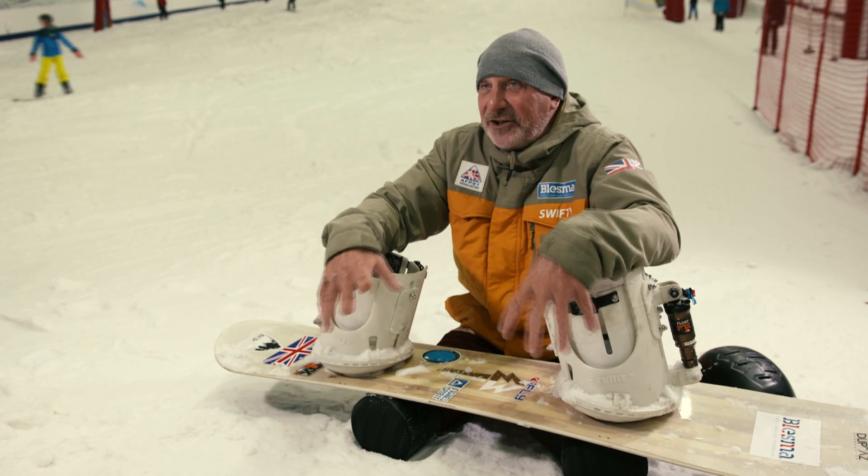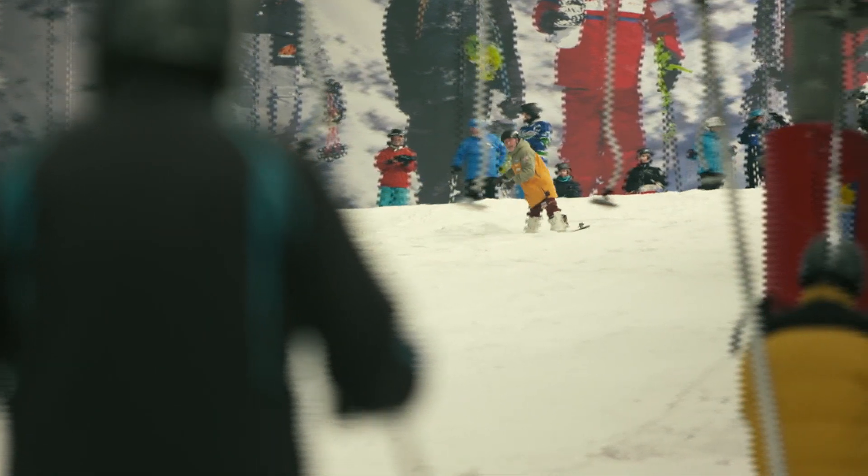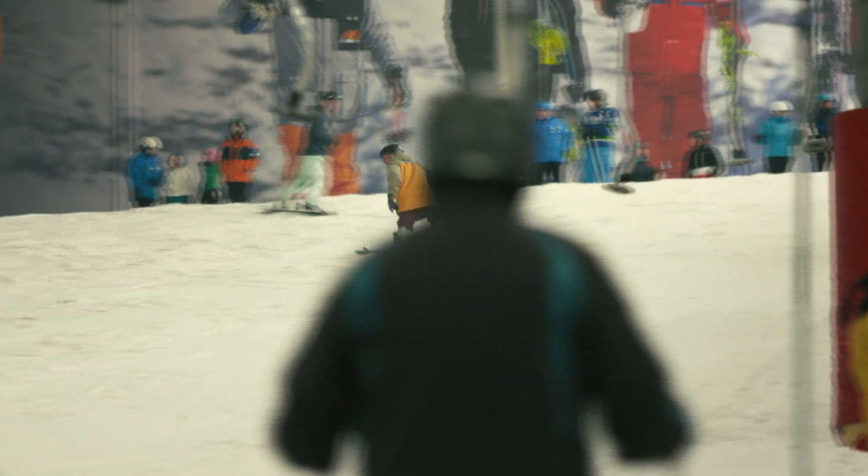These bindings are going to change that. He's hoping that if more people with a double above-the-knee amputation feel like they can compete, then the International Paralympic Committee will introduce a new category for them.